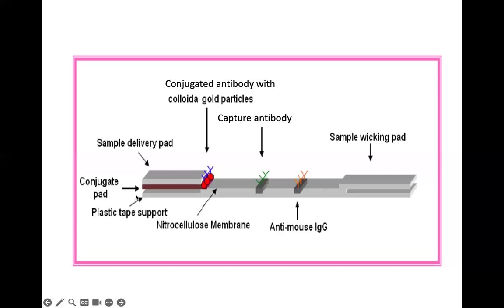After some time, due to experience, we finally got a nice reading, because it depends on how sensitive your detection is, meaning how low you need to detect the biomarker, the protein, the virus, the bacteria. How low you need to detect.